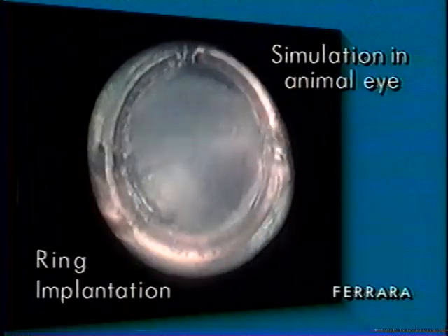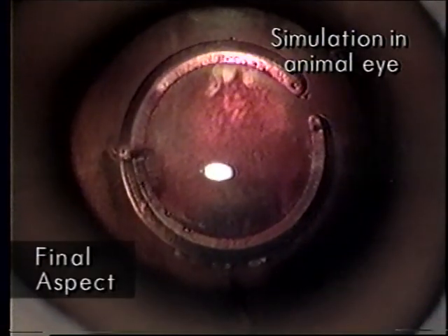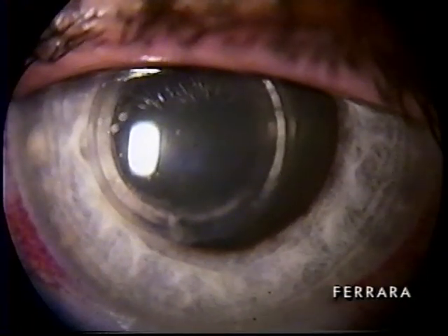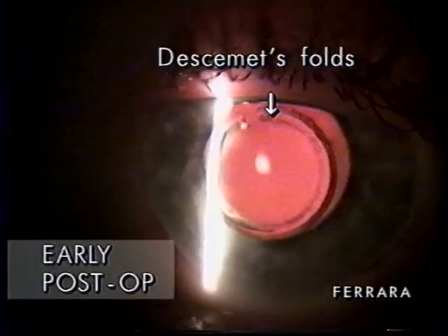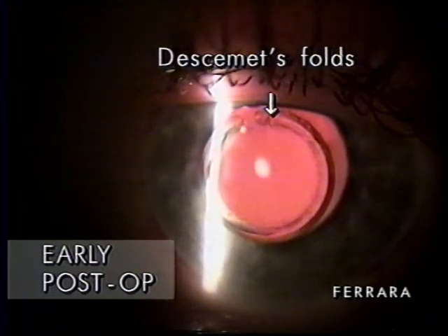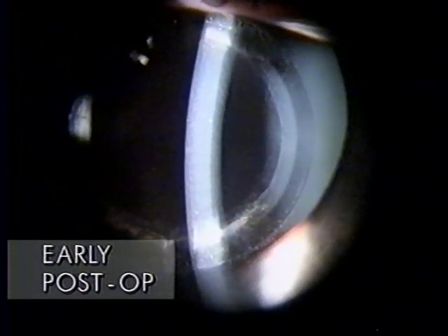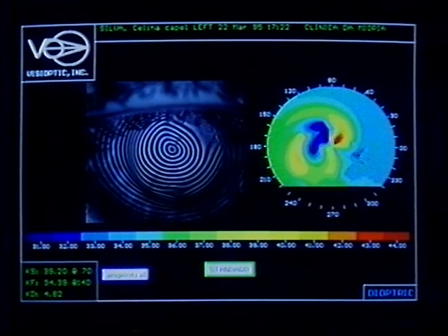Potential risks of corneal perforation are reduced, as the instruments and ring tips can be visualized throughout the entire process. Patient recovery is quick and usually uneventful. After 24 hours, there are no complaints of pain or other discomforts. In post-op, visual acuity enables patients to retake normal activities without the need for spectacle correction. At this stage, photophobia is the only persistent symptom.